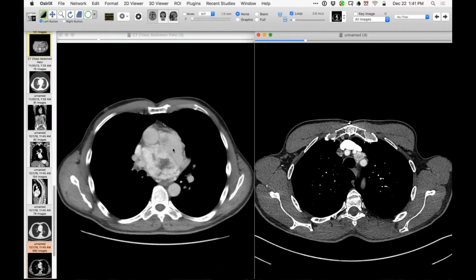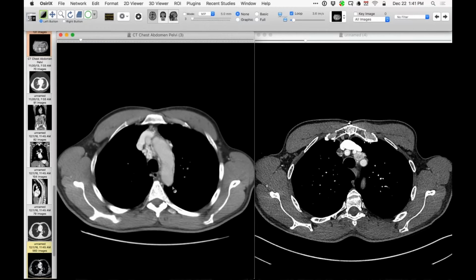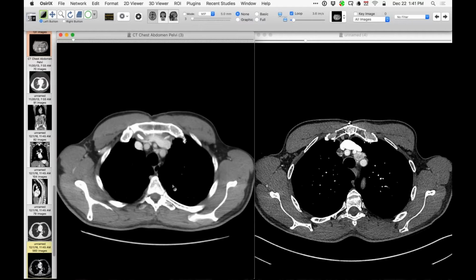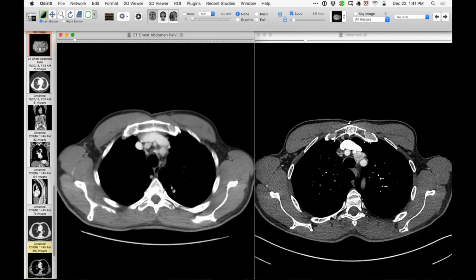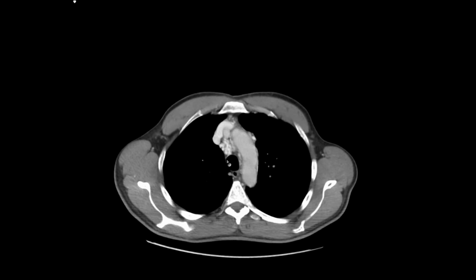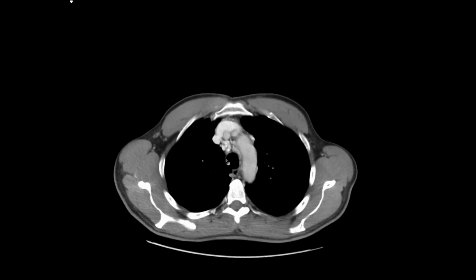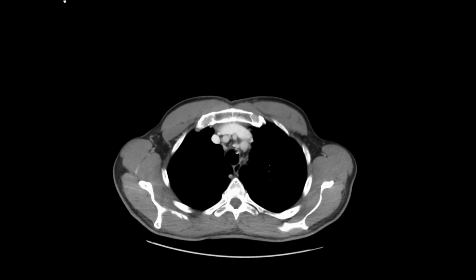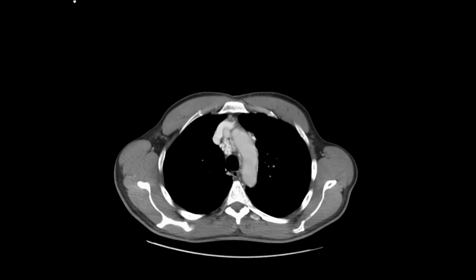So Howard, pretty interesting. Did the first one go up that high? Let's have a look up here. So we go up. Yes, not quite that high up there. It's right between the left subclavian and left common carotid. There's a little bit of it up there. Yeah, I wonder about that. That's pretty close. I was just wondering, could it be a second one? Yeah, it's possible. I mean, it's close. Maybe there was a little tissue there, I guess. But you're right, there wasn't a bulky mass there, but there was maybe a little bit. Pretty close, not quite there.